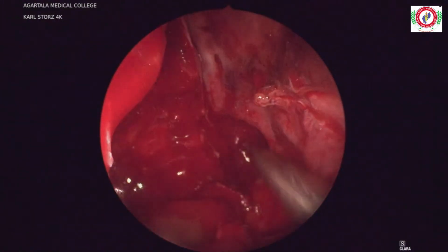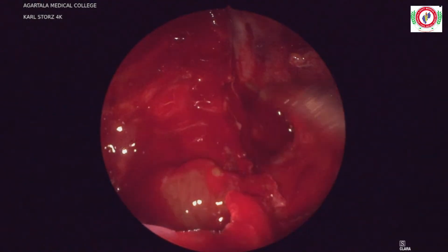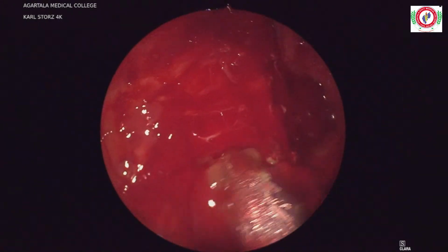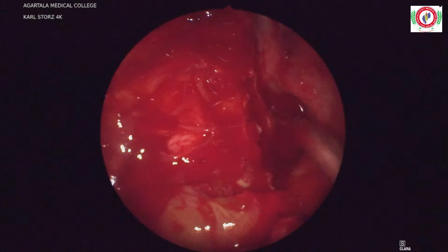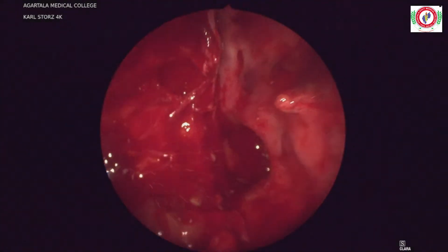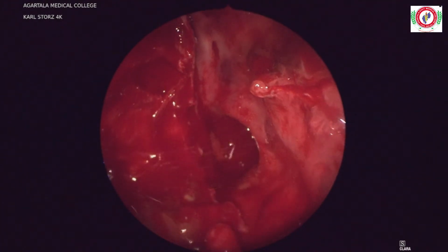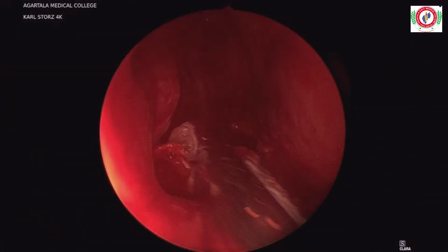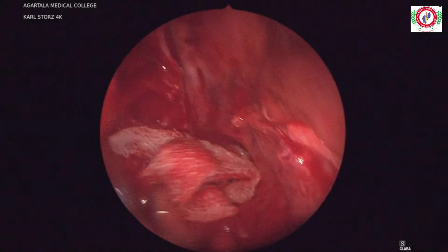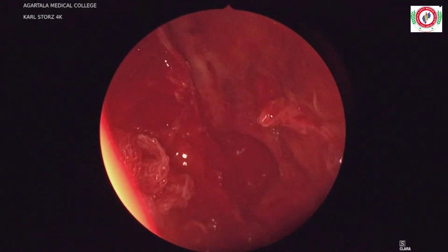You see, I am flush with the nasal floor now. Okay, you see, last bits of tumor are still there. So it is most likely arising from the floor. Okay, so I'll do a packing, give you a good picture, and then white balance, then maybe I'll come again. Give me a big gauze piece to pack. Give ribbon gauze to pack.